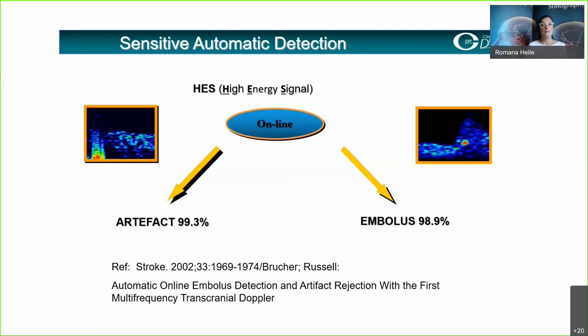So this will help very specifically where the operation technique has to be improved. And also it will give, let's say, a preview on the outcome of the patient after the operation.